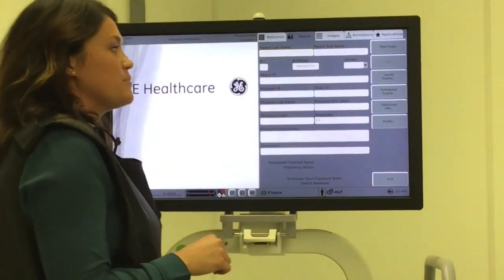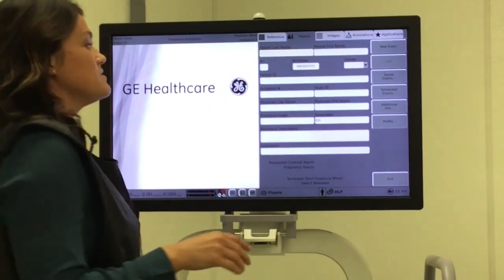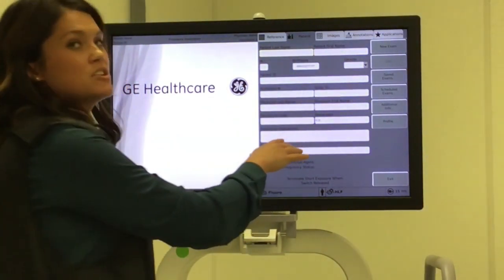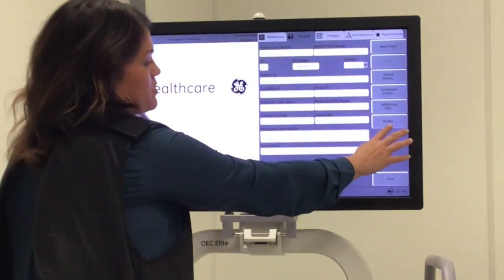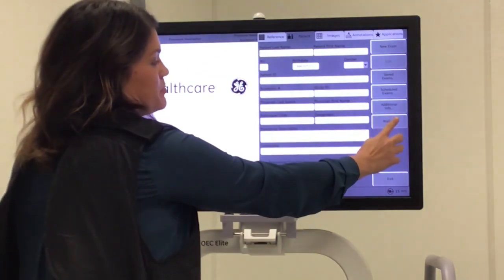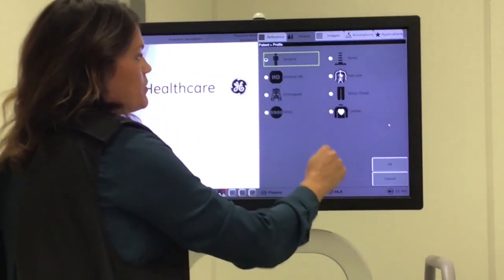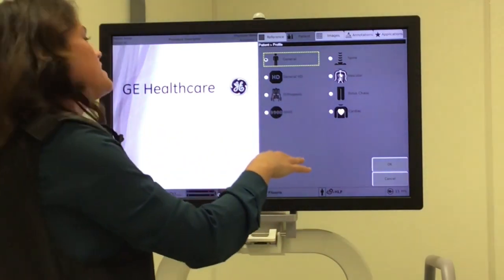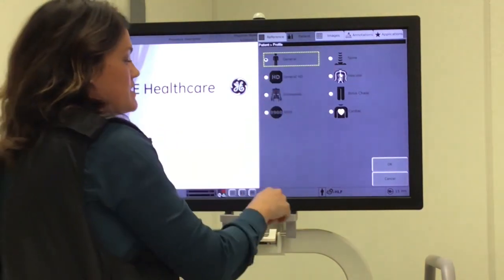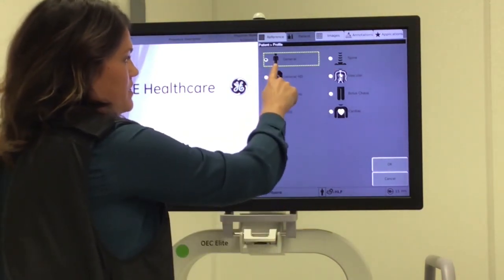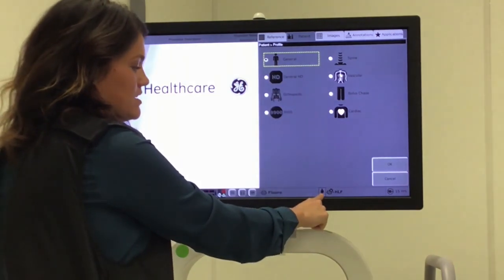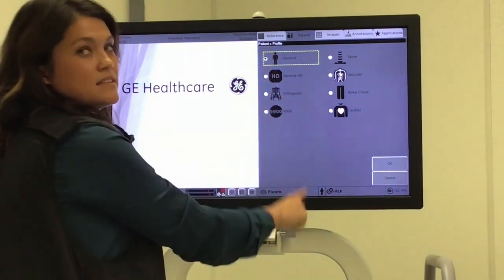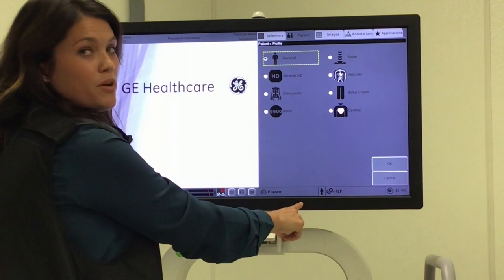There are a couple different ways that you can actually get to your profiles and change them. The first one is, after you enter your patient information, you can simply go over here and click the button that says Profile. Once you click on it, you're going to get all your options. This particular C-ARM defaults to the General Profile, and the way I know that is when I look down here on the status bar.